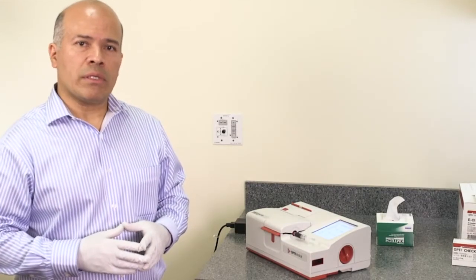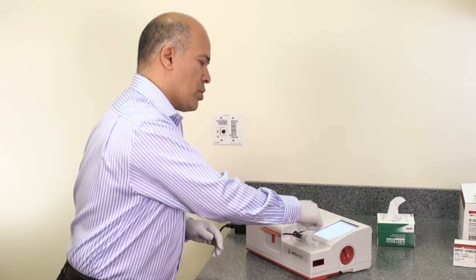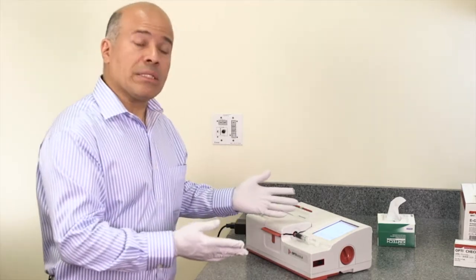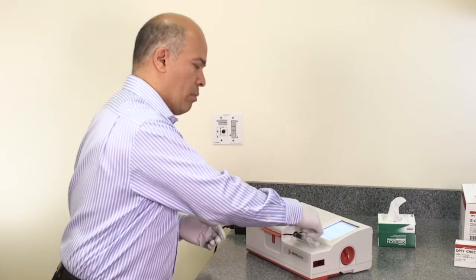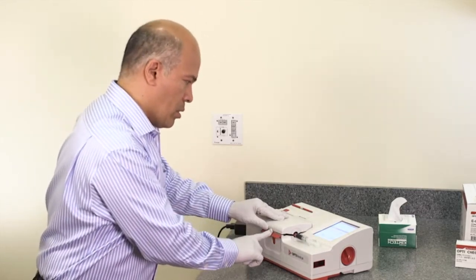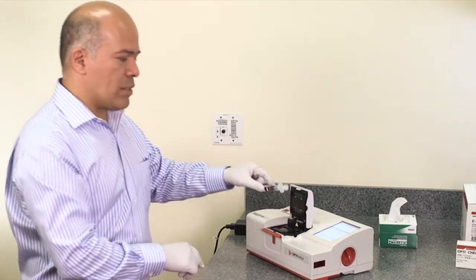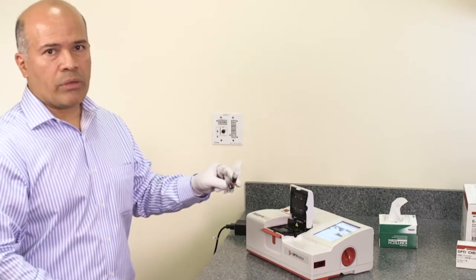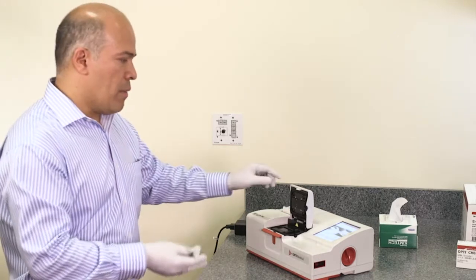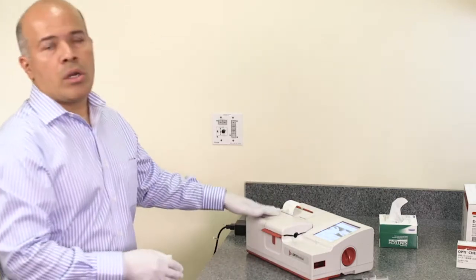Once the sample measurement is complete, the analyzer prompts the user to edit the patient sample if needed, or remove the cassette. At this point, press the red button, open the machine chamber, and discard the cassette with the sample according to local regulations. The results are also printed on the printer.